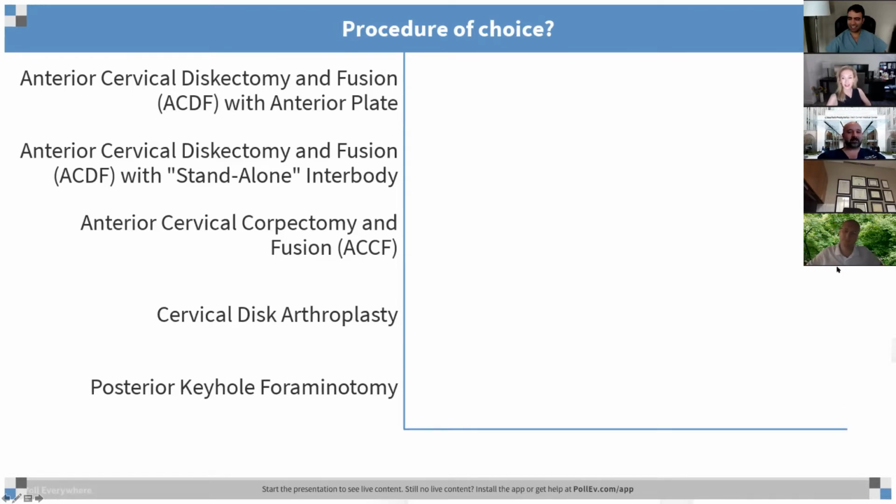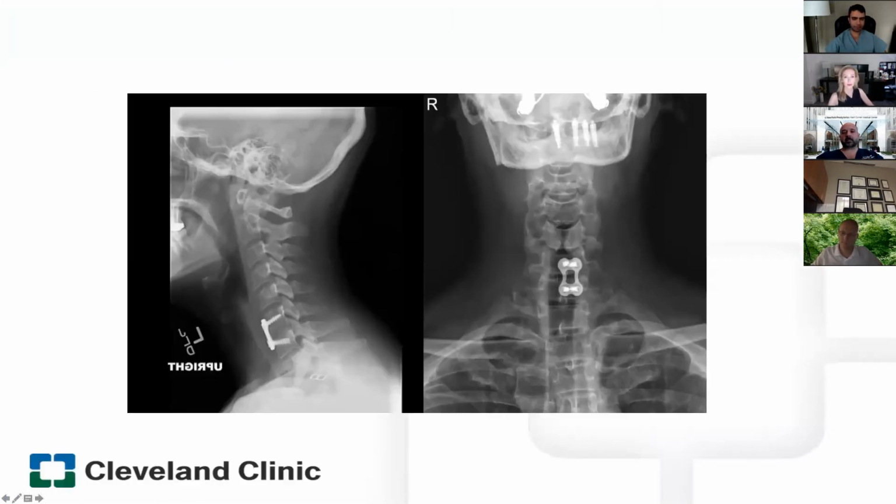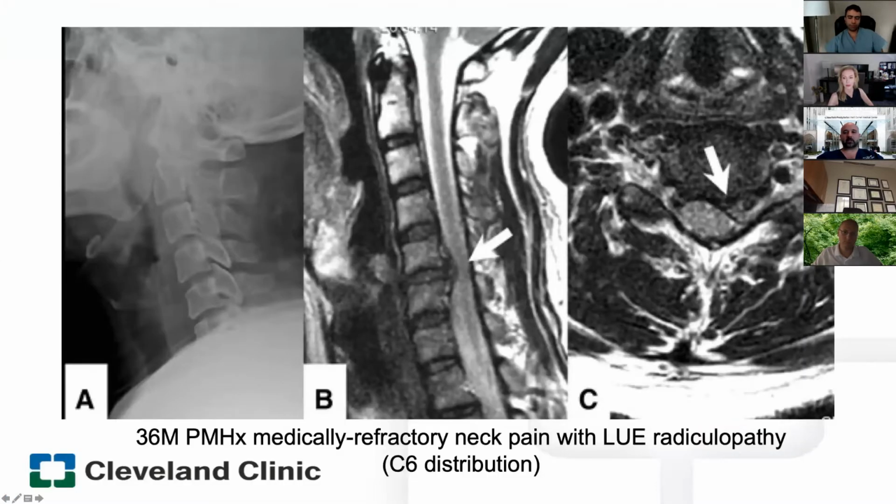Thanks, Jonathan, that's obviously a great case to start with. A very common scenario, right? We see that in clinic day in and day out. I just want to make sure everybody in the session understands that, of course, this patient exhausted medical management. You don't want to jump straight to surgery. Exactly. But let's assume he has failed medical management. He has tried injections, physical therapy, NSAIDs, and it's surgical.